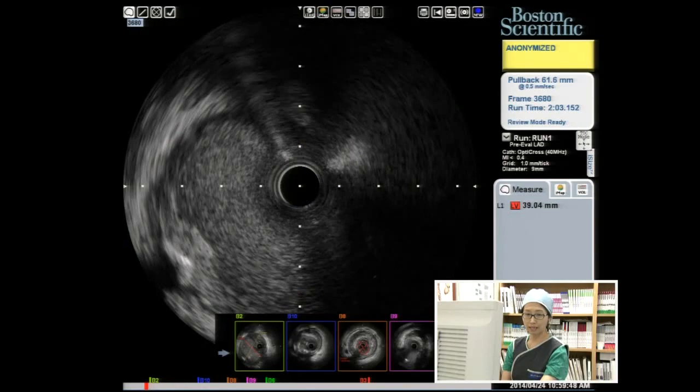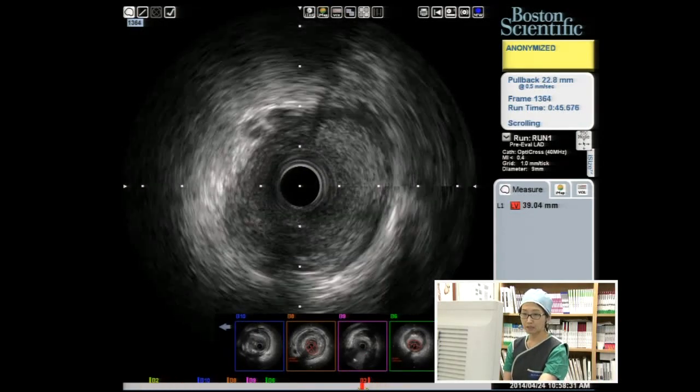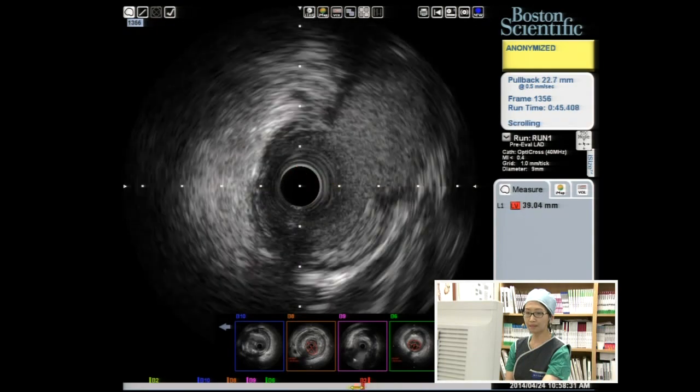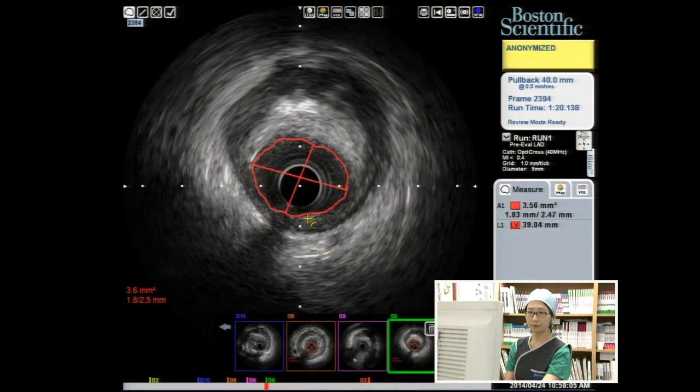And then we check the measurement, and I will show you that. So it is just below the big septal branch, and this is maybe the landing site. The vessel size is 3.4 millimeter, and lumen size is 3.0 millimeter. Then the left LAD minimal lumen area site is here. The lumen area was 3.5 square millimeter, and the whole proximal to mid LAD lumen area was 3.5 to 4.0 square millimeter, but it is very diffuse.